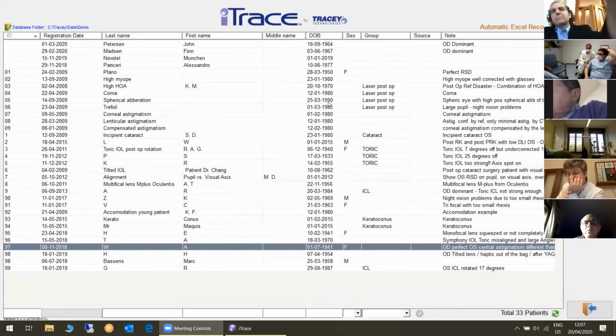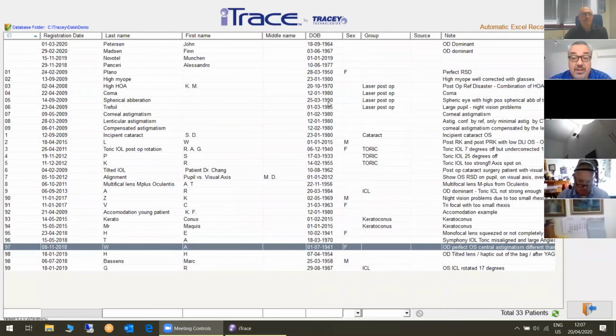The importance of ray tracing wavefront acquisition is that it is always related to the vertex acquisition. So we can use it independently from the diameter of the pupil. When we acquire with Hartmann-Shack, we always have to consider that the wavefront is related to the pupil center.